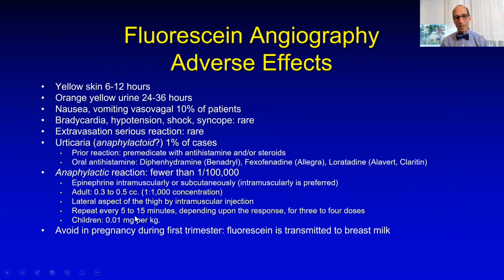There's a whole bunch of adverse events. If you're doing fluorescein angiograms, I think you legally have to have a crash cart because people can crash. It's not very common. They do get yellow. Your photographers usually tell people this. Yellow skin, orange urine, not to worry about that.